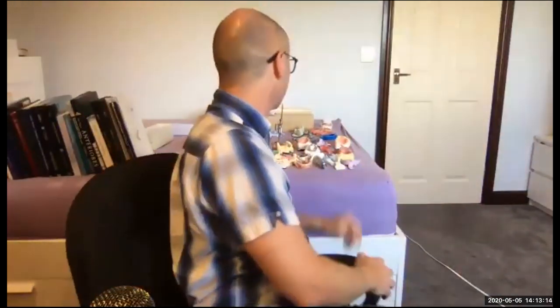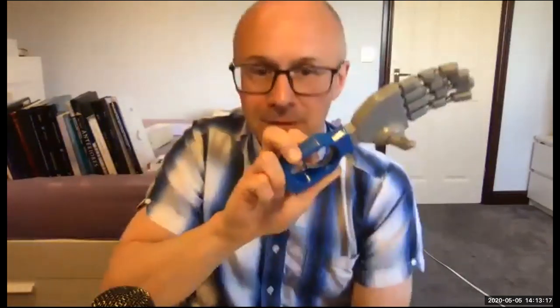Dennis Osmanov, pivoting, is that an issue with sticky food? Yes, until the patient gets used to it. But Dennis, this is really important: it's all about warning the patient before we actually do the treatment. That's why I show them that pivoting denture on locators before we do it and say, when you have this made, it's going to be like that. It's going to want to rock. If you chew sticky food, the back bit will lift, and you'll have to learn, just like a prosthetic hand operates totally differently than a natural hand. It's just like a denture.